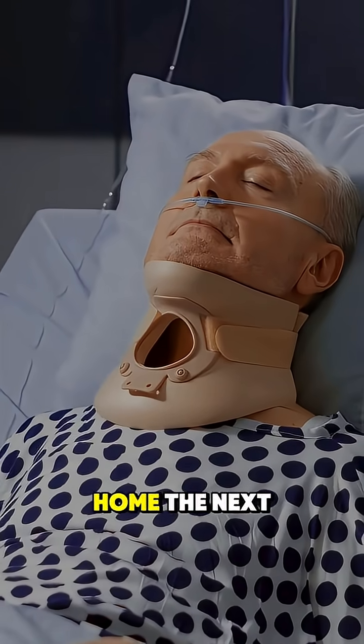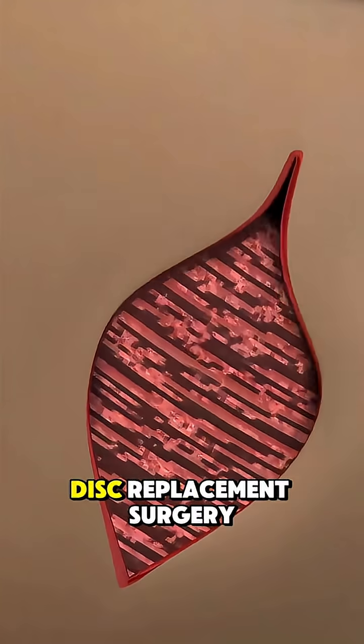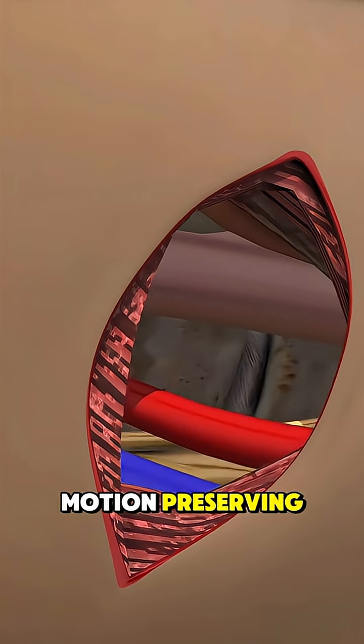Most patients go home the next day and recover in a few weeks. And that's how cervical disc replacement surgery is done — precise, modern, and motion preserving.